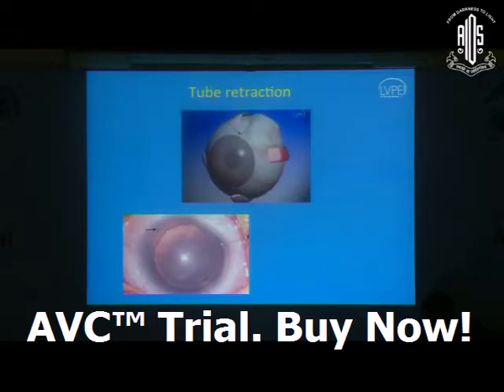So tube retraction is another problem, especially in children. This was one of the first children that I had operated with aniridia. You don't want a very long tube touching the lens because it's crystalline, and you don't have iris to support it. And the lens is crystalline, so I didn't want to do it in the pars plana. So we really don't leave a very long tube.